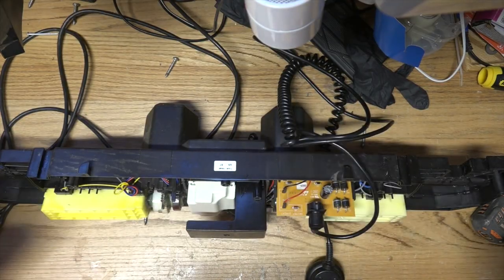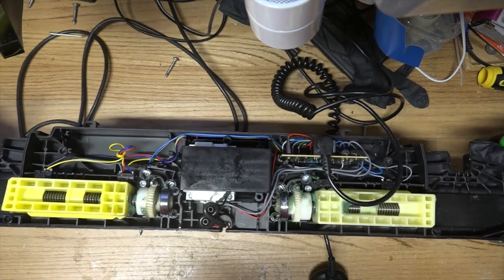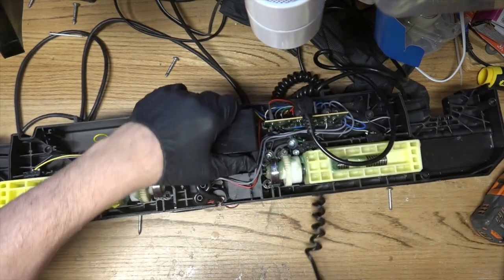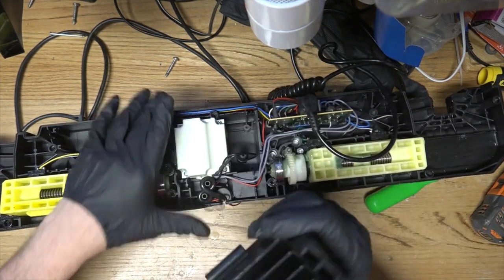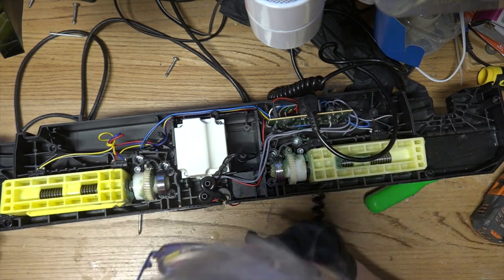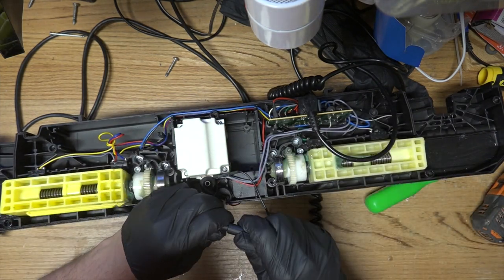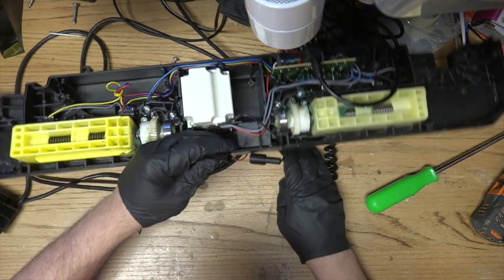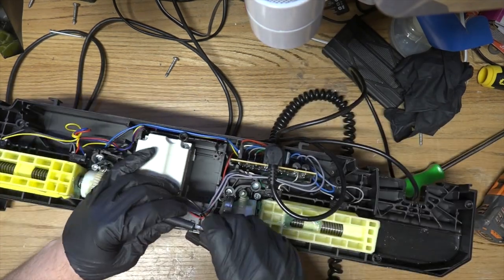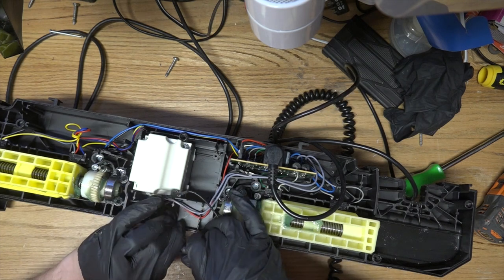Very good. All right, let's tip her up like this. You can see there's nothing in here, but there are some channels underneath, like maybe it's for airflow. I don't know. Let's take a look and find out here. Should be able to just pull that guy off now. Yeah, so you see, what's the whole point of this? Is it channels for wires to go? I mean, there's only one wire that's back here, and this seems like, what, a fuse? Let's take a look. Oh yeah, it's a fuse, all right. The desk is not level, so everything rolls back severely. Yeah, so let's put that fuse back in. I don't know what that's all about.